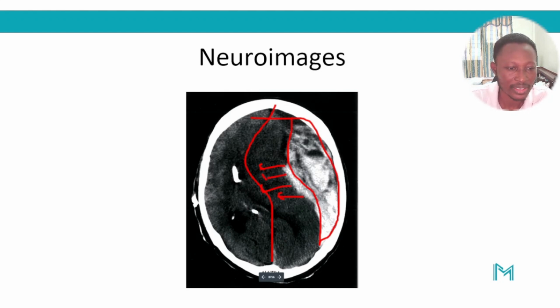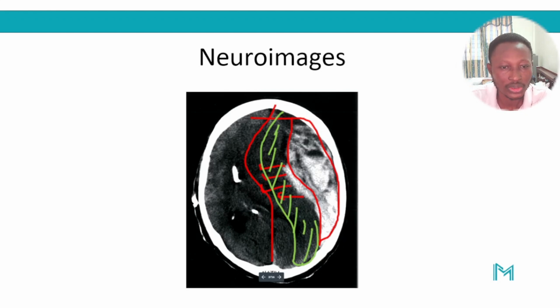And even when you look at this area shaded green, it looks a little bit smoother than the rest of the brain. So there's sulci effacement, and this is cerebral edema, a perilesional edema. Then you can't even find the lateral ventricle on the left side of the brain, where the side of the lesion is, but you can find the posterior horn of the right lateral ventricle over here, and it is very dilated.